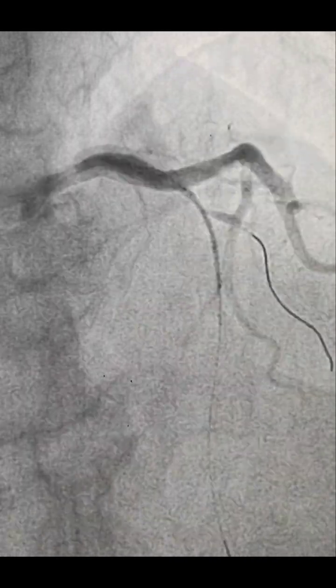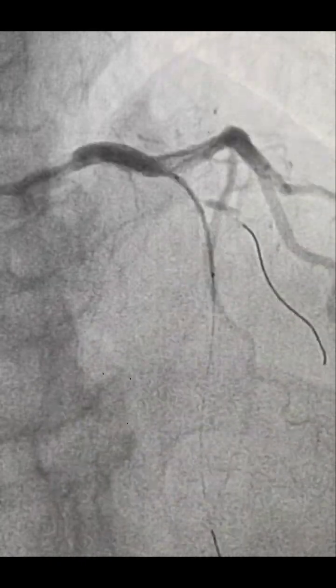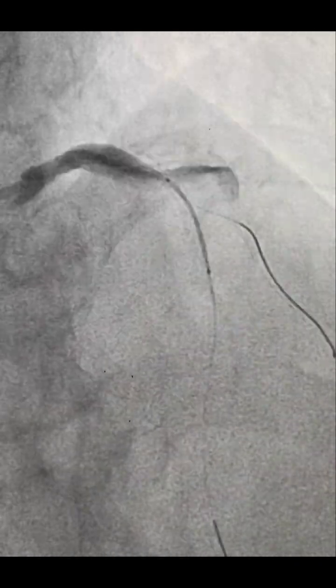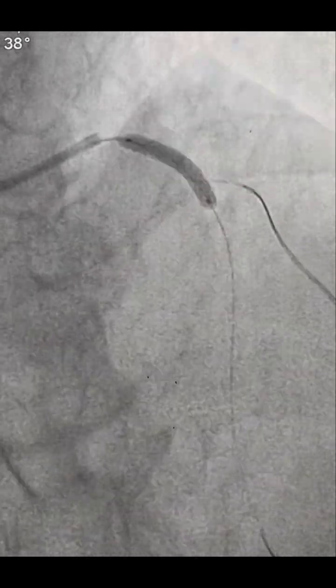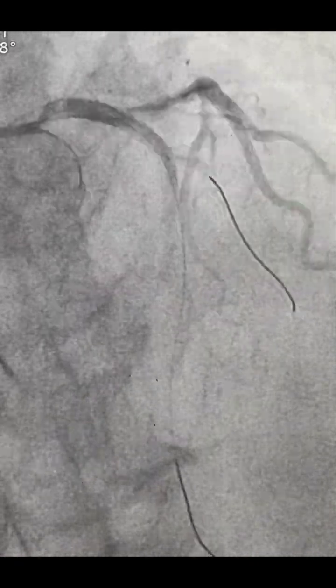And then straight away I took a 3x24 drug-eluting stent, and without dilatation I went ahead with this stent directly, and you can see there is no flow at all after positioning the stent. The stent was deployed at around 14 atmospheric pressure. It was a 3.0 stent, and RBP was 16. And as we anticipated, there is slow flow, no flow after putting in the stent. So now what to do?